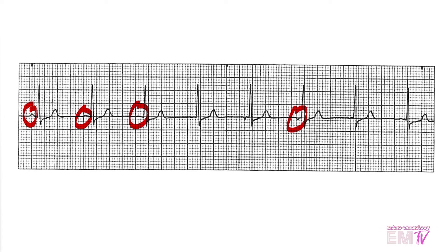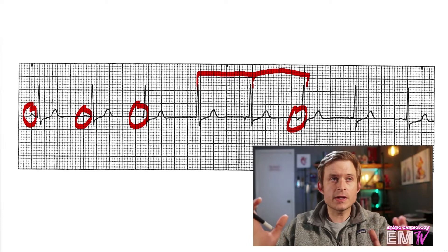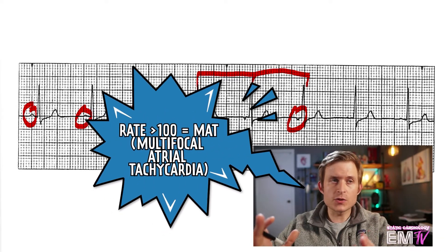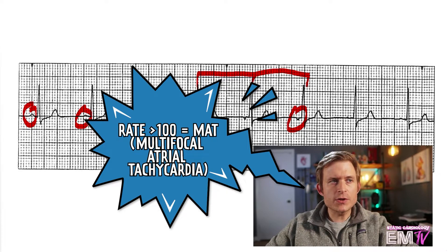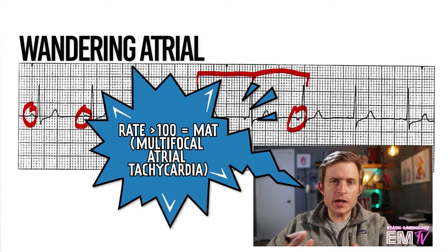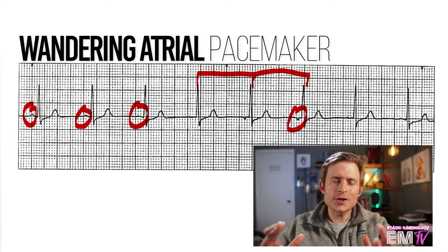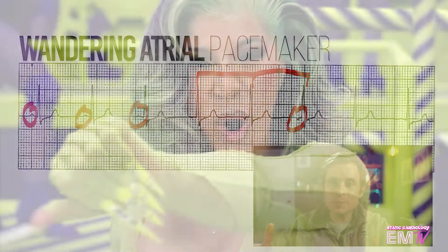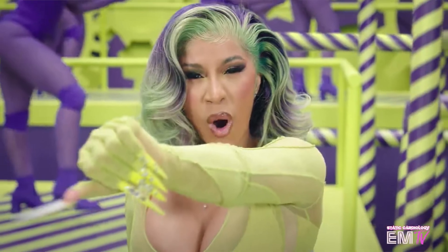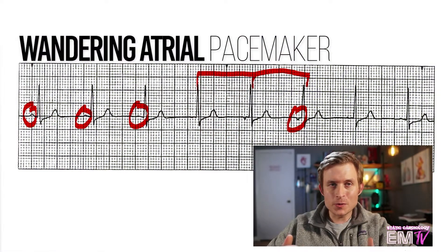The R to R interval here is also nice and regular. Now, because I have at least three variations of P waves present and the rate is under 100, this meets the criteria for wandering atrial pacemaker, otherwise known as WAP — formerly called WAP, but Cardi B kind of ruined that acronym for EMS and for rhythm interpretation.